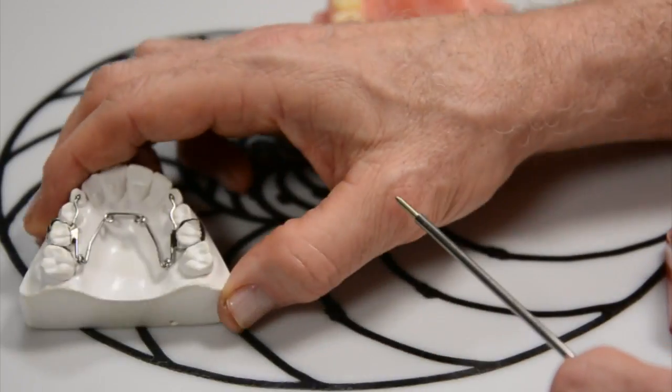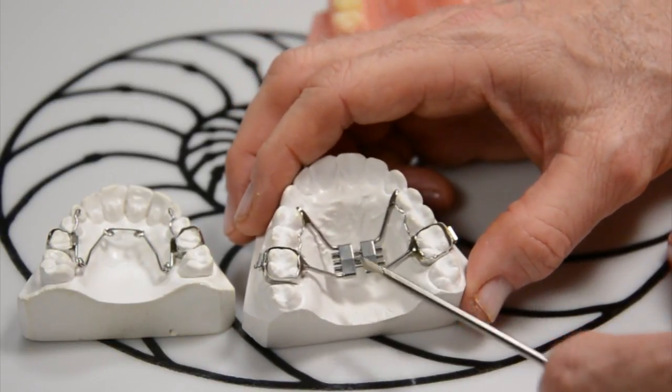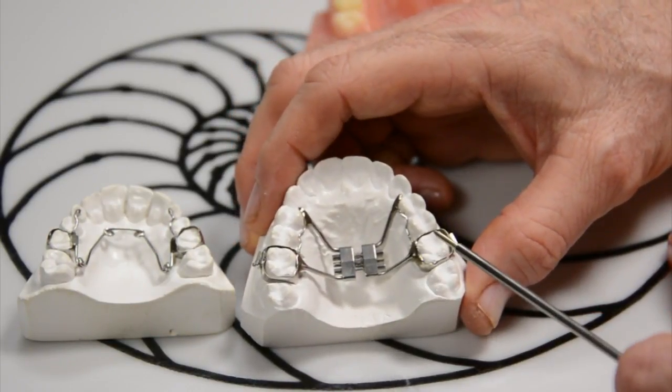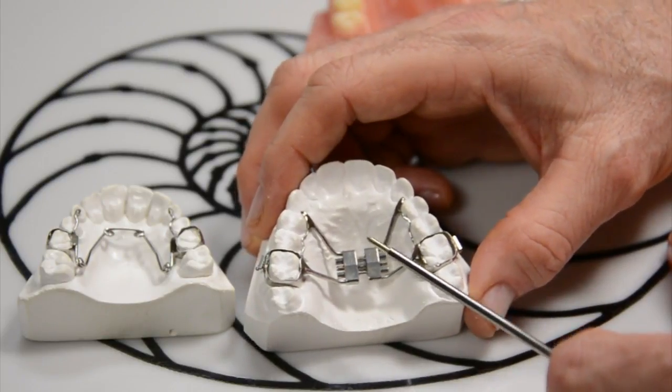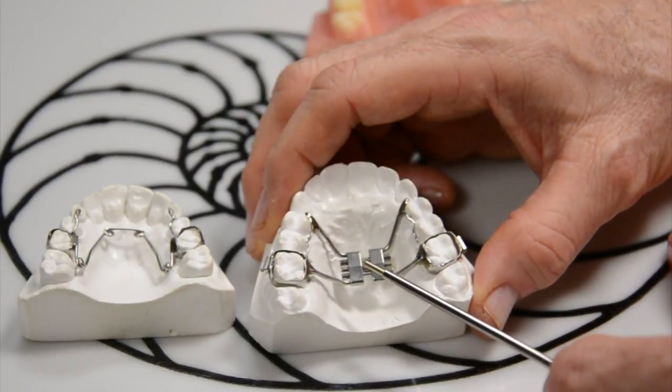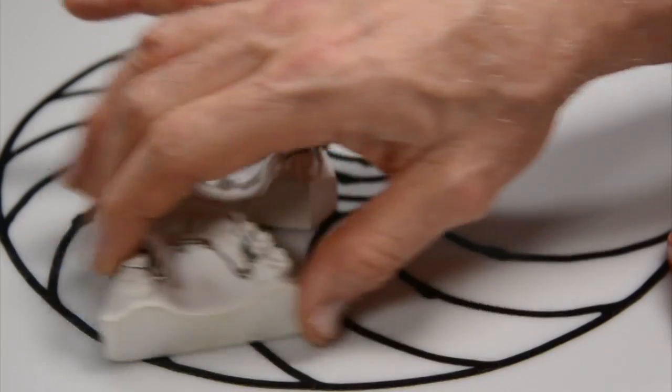There's another way of doing it — a device called a hyrax. This device has a key that mom or dad turn twice a day. It's a little more painful, traps food, and the kids talk rather funny. So we tend not to use the hyrax in our office; we tend to use the quad helix.